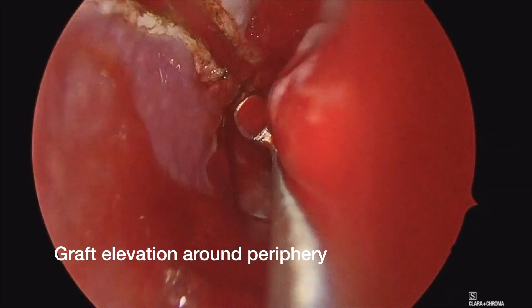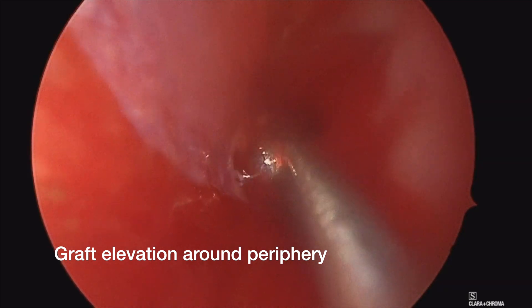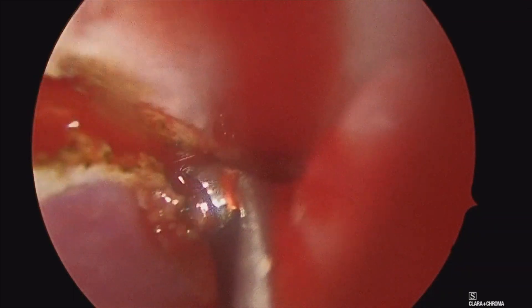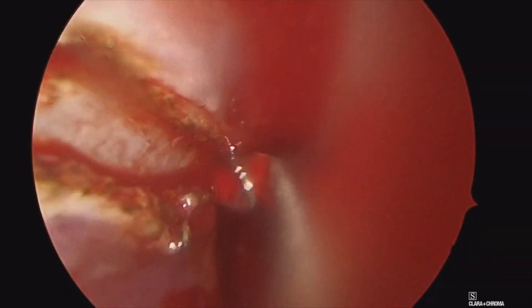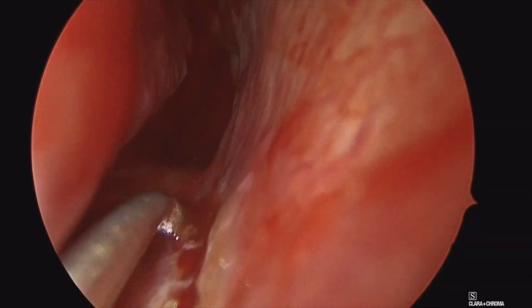Here we are with a curette just making sure all the edges of the graft are cut through with our needle tip bovie cautery. That is much easier to do now than at the end once you have this mostly mobilized. You can see it's just cutting right through the last bit of the periosteum there along the lateral wall and here on the nasal floor.